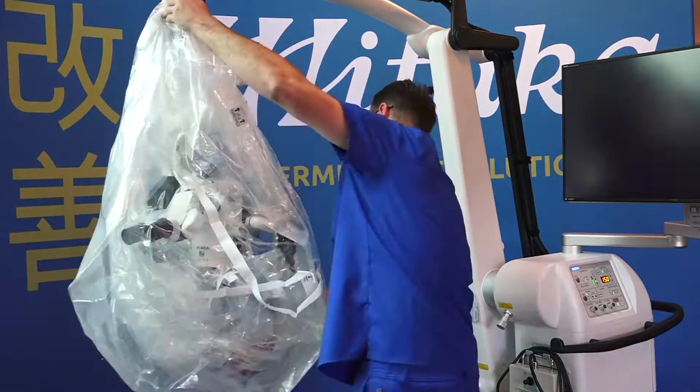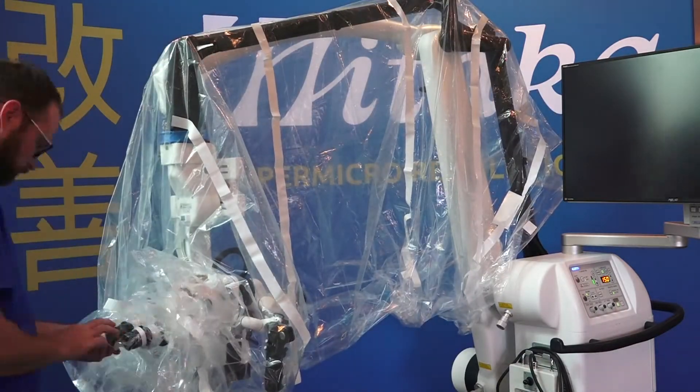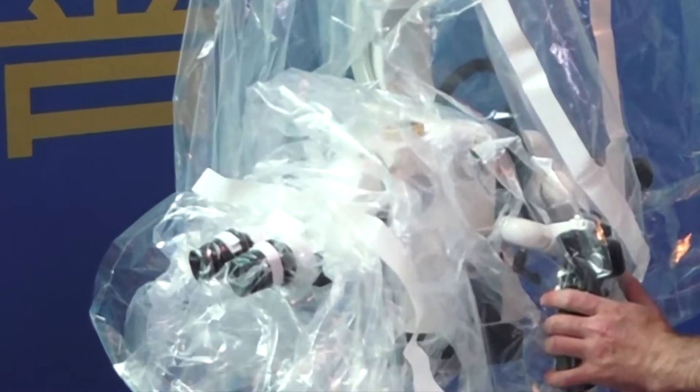When affixing the Velcro straps to the eyepieces, you will notice a cuff. Ensure that the Velcro straps are on the side of the cuff closer to you, further from the microscope.